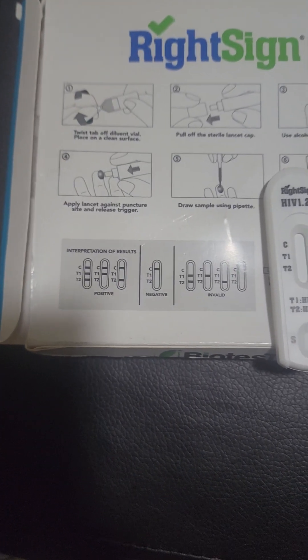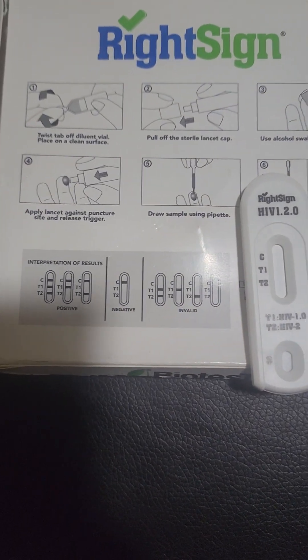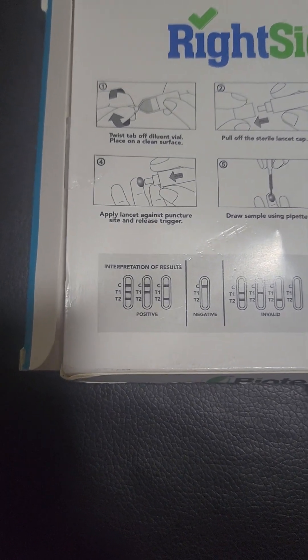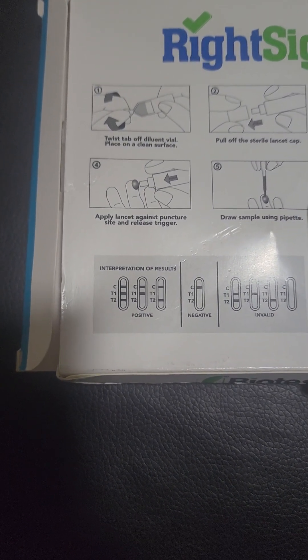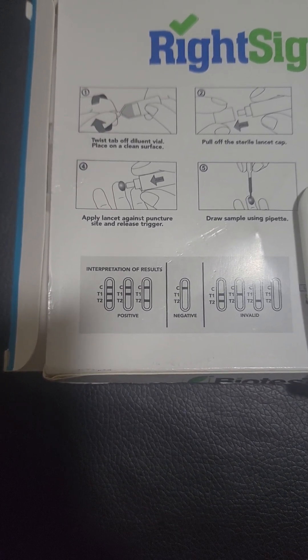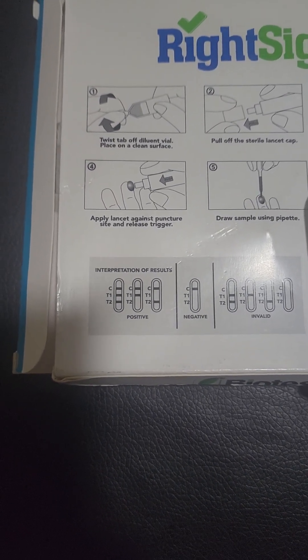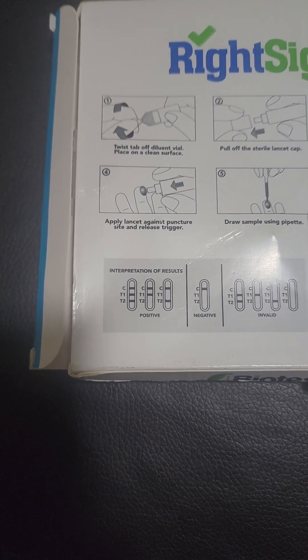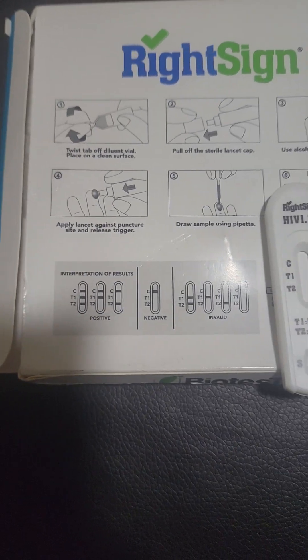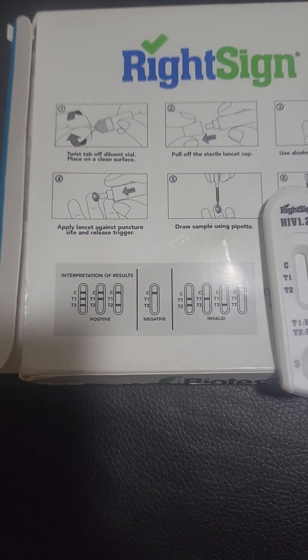The test is interpreted as follows: once you've entered the sample, you will get an indicator on the strip. If the control line is activated along with T1, T2, or both, the test is positive and you will need to do a follow-up full blood test to confirm the results. If the test is negative, it will show one line on the control or C.